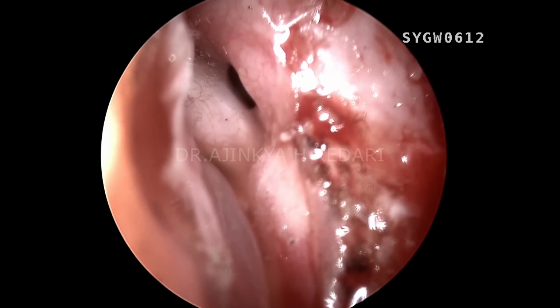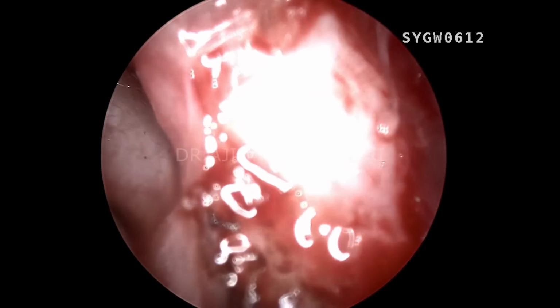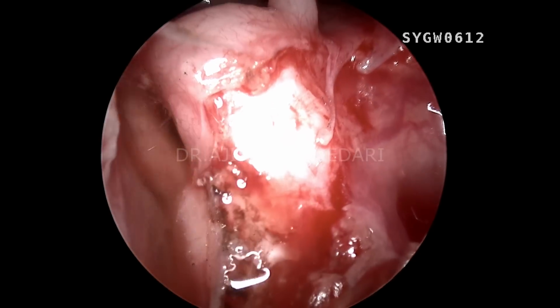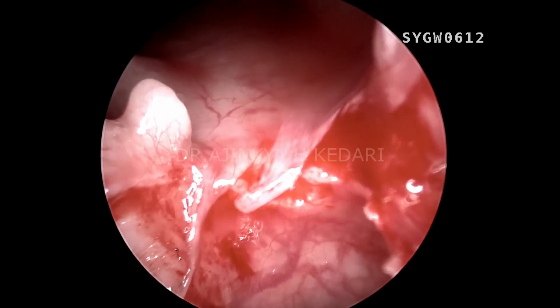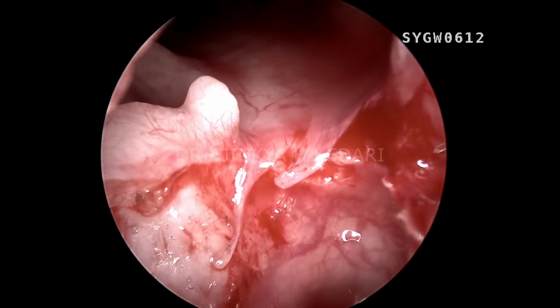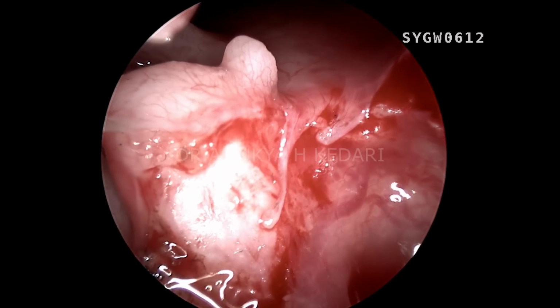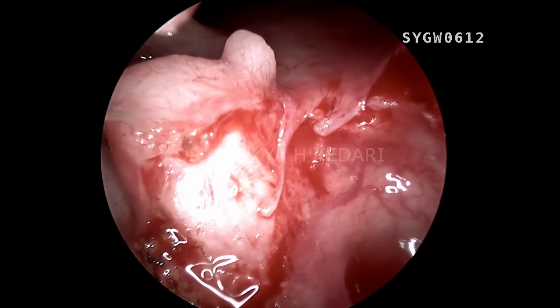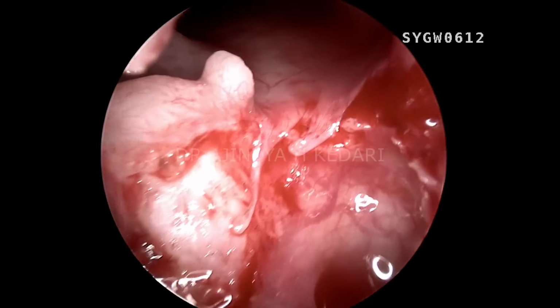That is a huge defect. You can see a blackish shadow over there. That is actually the defect, and through which you can see the CSF coming out. So that's the frontal lobe of the brain exactly behind that, and that's the superior half of the frontal sinus. You can see the dome of the frontal lobe above, and you can see a lot of irregular bony margins on the posterior wall of the frontal sinus as such.